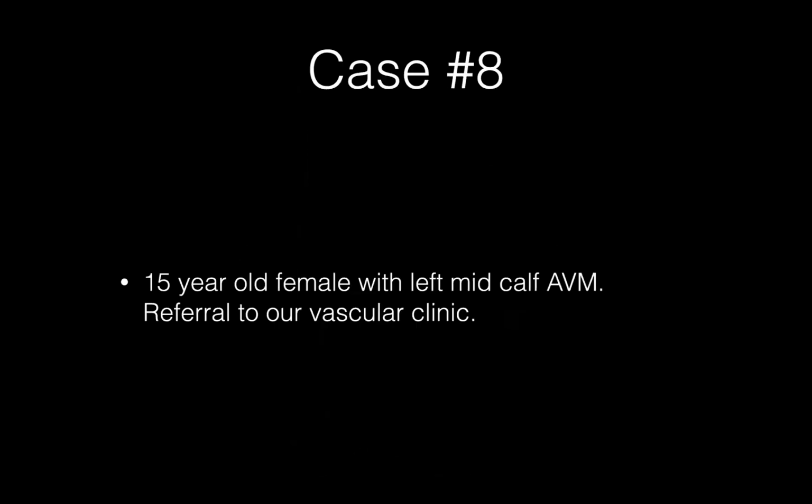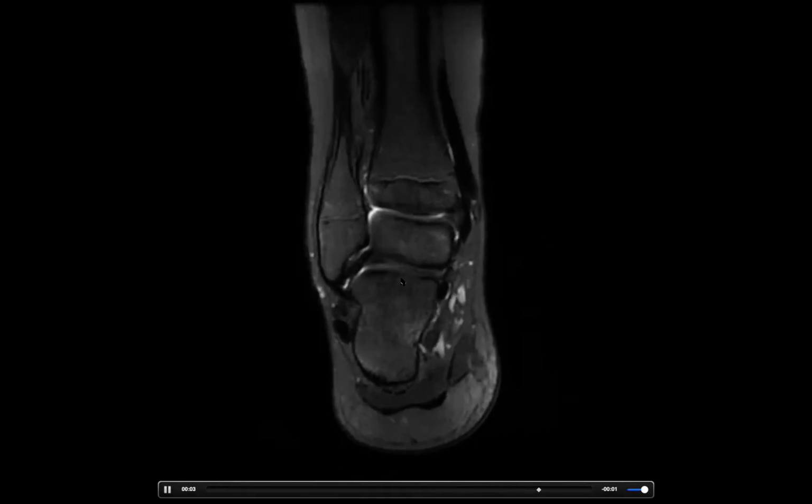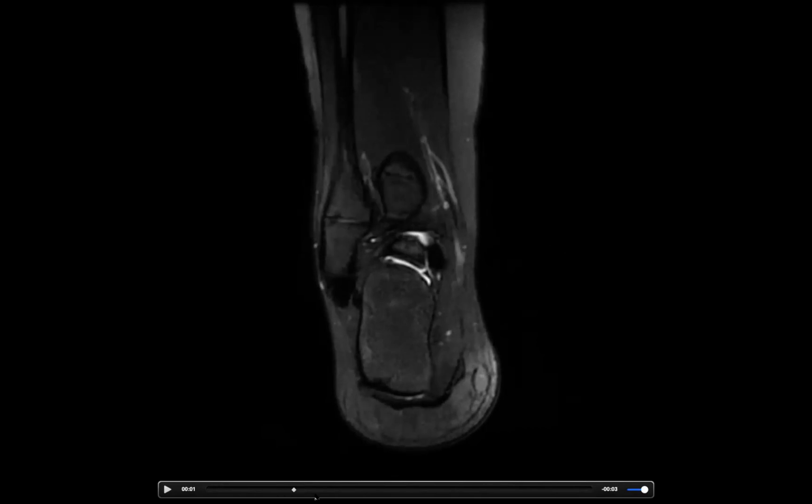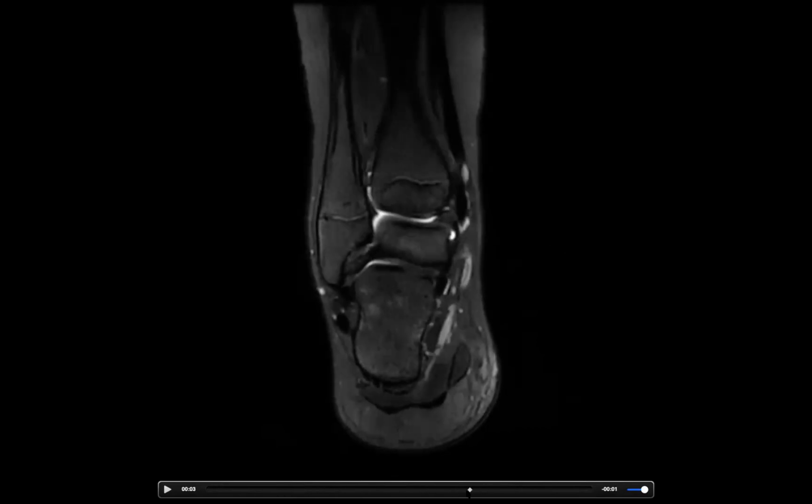Oh, just one thing. So T2 shuffle, just for those who are not familiar, is just a sequence that allows you to get in a single sequence different T2 weightings, from proton density to slight T2 weighting and a lot of T2 weighting using computational methods. So that John Tamir developed when he was a PhD student here. Now he's a professor at UT Austin.